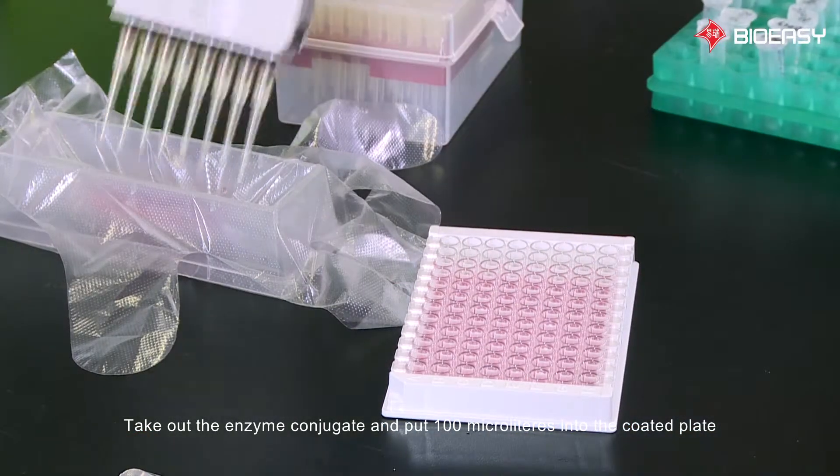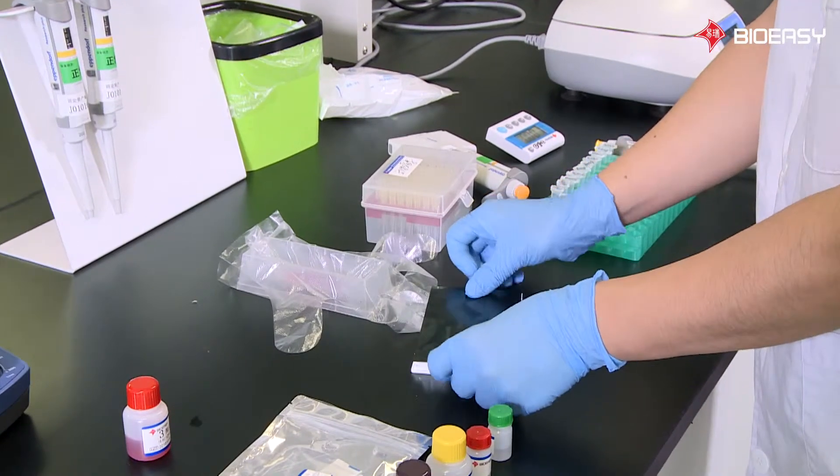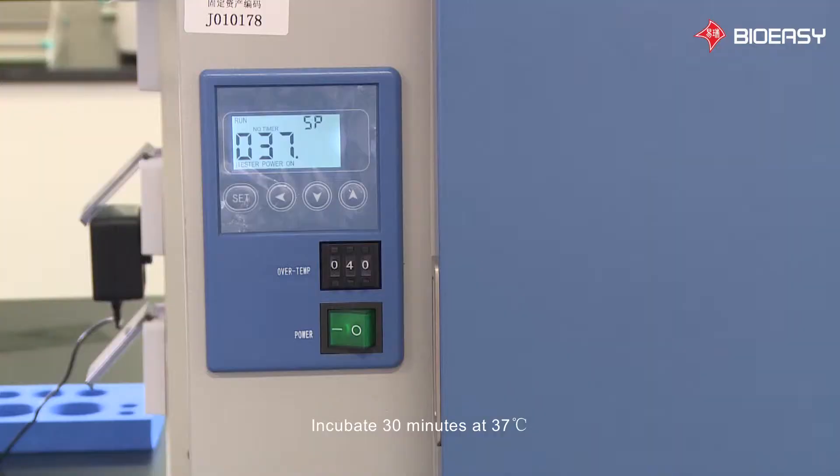Take out the enzyme conjugate and add 100 microliters into the coated plate. Incubate for 30 minutes at 37 degrees Celsius.